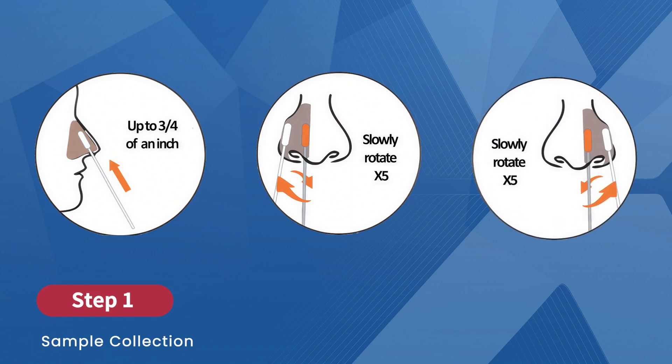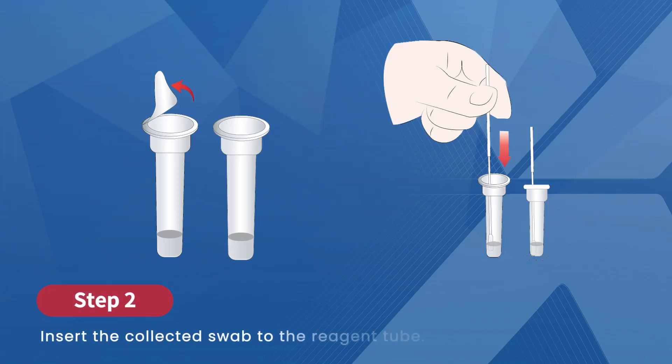Then, using the same swab tip, repeat the same steps in the other nostril. After collecting the sample, peel off the aluminum foil from the top of the reagent tube. Insert the swab into the tube until the swab head touches the bottom, ensuring the sample is fully immersed.